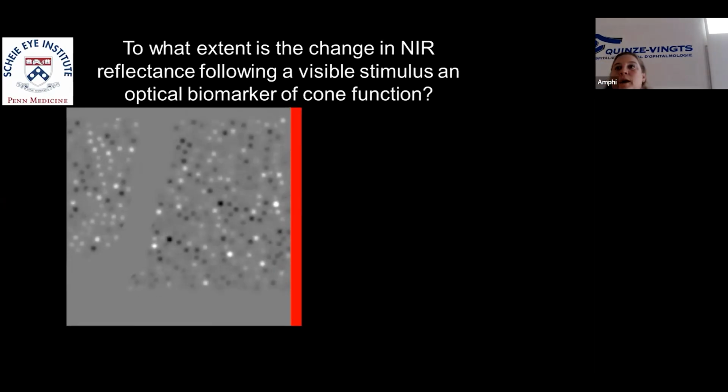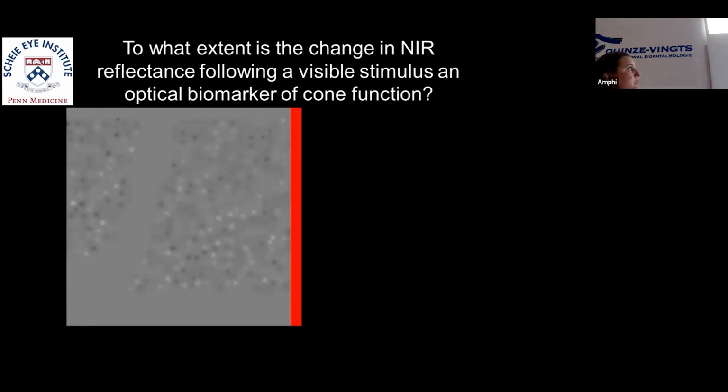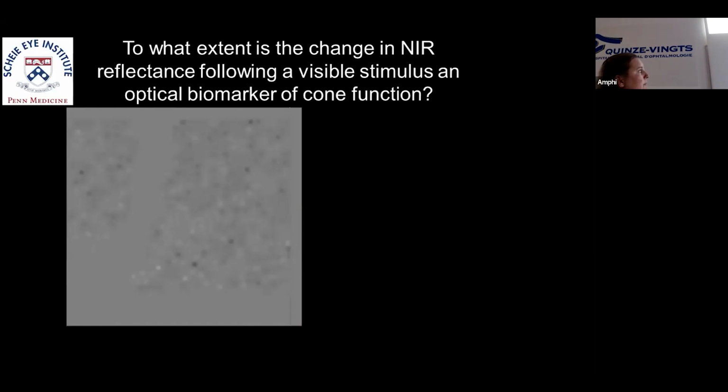The first thing we had to do was find a way to quantify this signal. We spent a long time on this because the signal was so heterogeneous between cones. What we settled on is a technique that's fairly well used in neuroscience, which is to standardize the cone's behavior. We standardize the reflectance for each cone across the image, meaning that we give the overall ensemble of cones a mean of 0 and a standard deviation of 1 in the pre-stimulus condition. Then when the light comes on, we watch how the cone's reflectance diverges from its initial value. This video shows the pre-stimulus condition as the uniform gray appearance, and then the light comes on and you see the cones diverge and get either bright or dark in comparison to their pre-stimulus reflectance behavior.